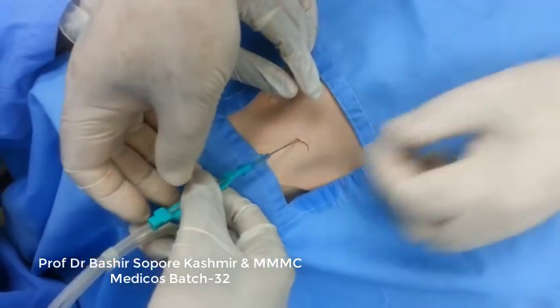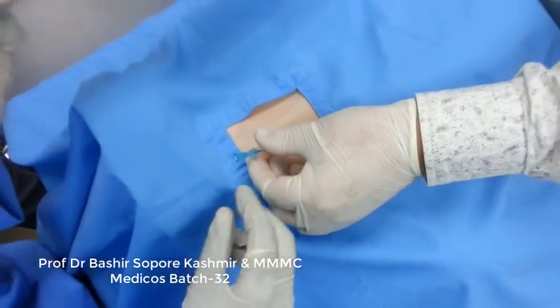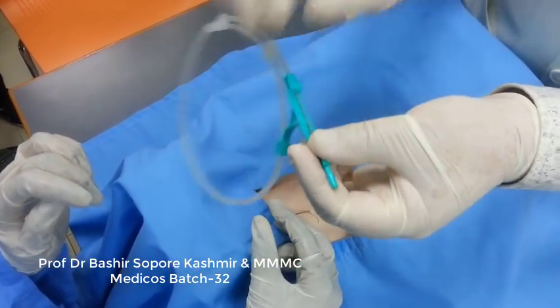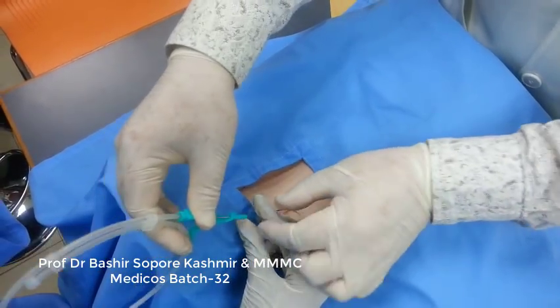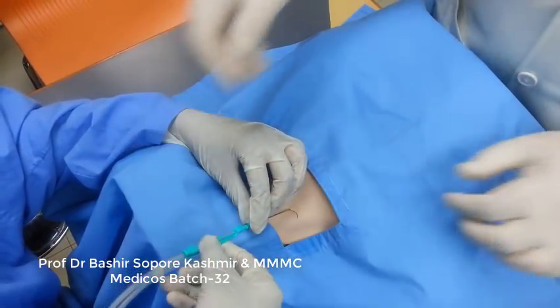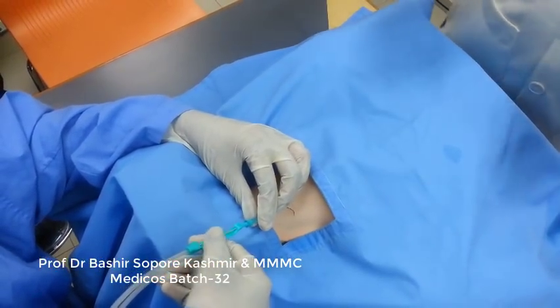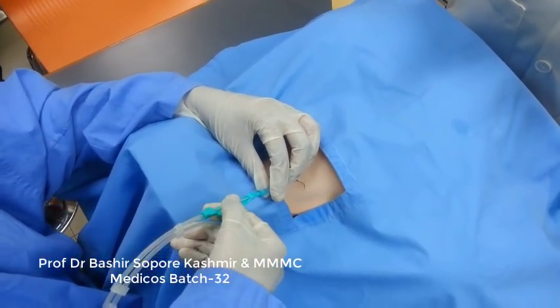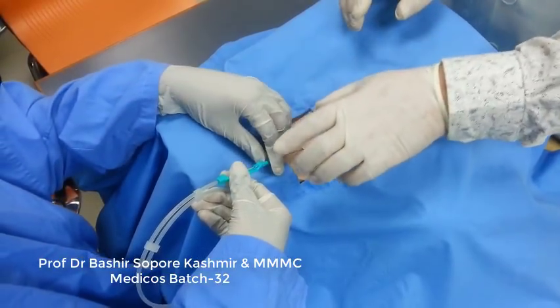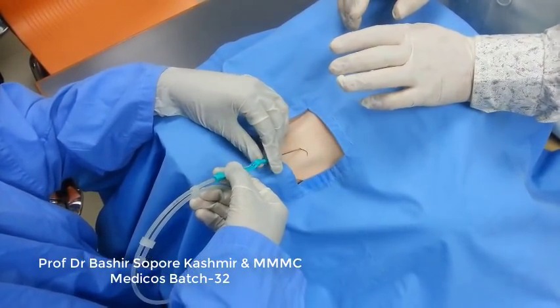So I can show it. Let me show it again. You take this, this is the J wire. You straighten it like this. After straightening it like this, you can introduce it like this. Now move the guide wire. How much is the guide wire to be advanced? Now listen, as I said, that guide wire was having markings 10 and 20.